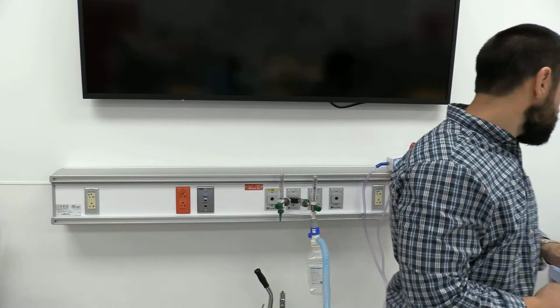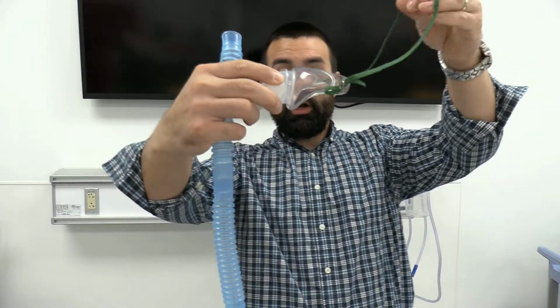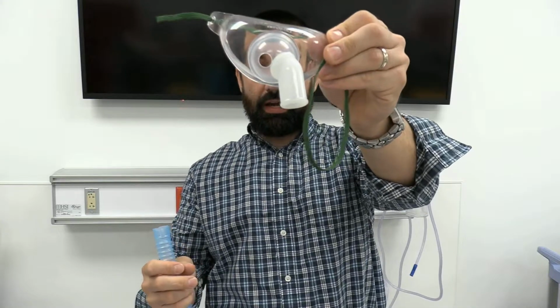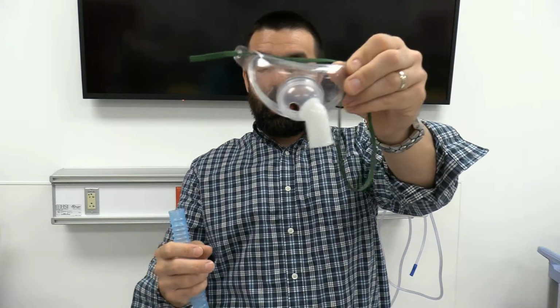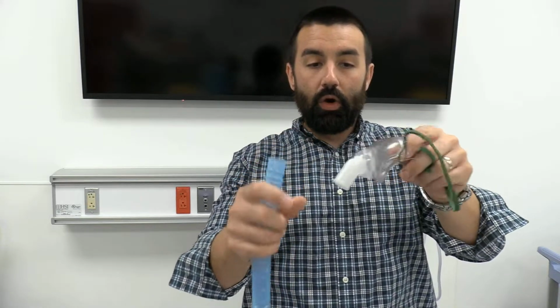So what are some other things we can hook to? The two other kind of common ones, we have a trach collar or trach mask, okay? So you notice how that thing is kind of cut on a bevel or an angle. People put this thing upside down, okay? There is writing on there, so you should be able to see clearly, and the writing's always going to be kind of in an upright manner here.